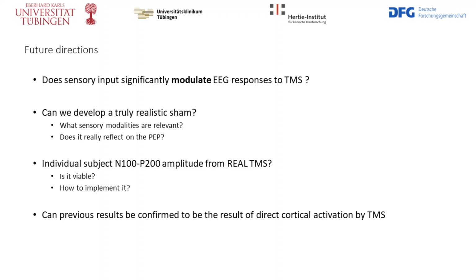Now, I believe that here we have demonstrated a procedure that can effectively exclude the peripherally evoked responses from TMS EEG measurements, thus revealing the true cortical response from direct activation by TMS. However, I understand that this is not a perfect solution and might even be a bit of an overkill. This means that I believe it can be improved. First, it will be important to investigate whether sensory inputs significantly modulate the EEG response to TMS. Secondly, this method can be used as a gold standard to then develop a truly realistic sham.